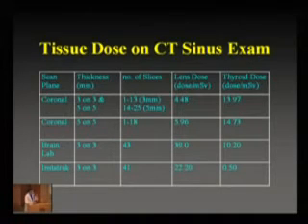But if you are doing, say, image guided surgery, like previously we have been using the InstaTrak, it is essentially axial images. And that's why the amount of irradiation to the lens can be a lot more. But because we are doing axial images, the amount of radiation received by the thyroid gland is actually very little. And the BrainLab is something in between. They do both coronal and axial cuts, and that's why the dose of irradiation can be variable.